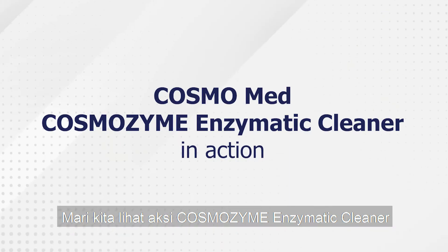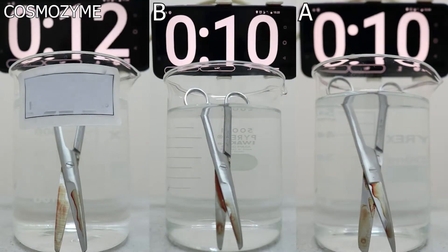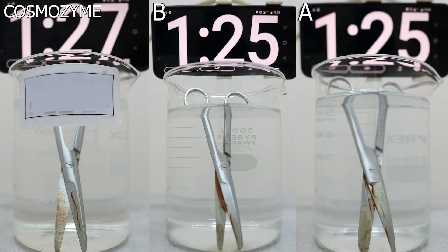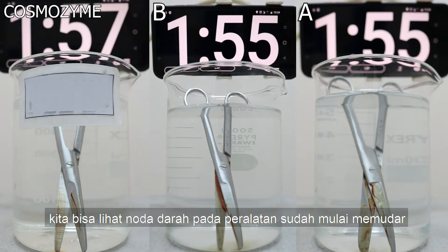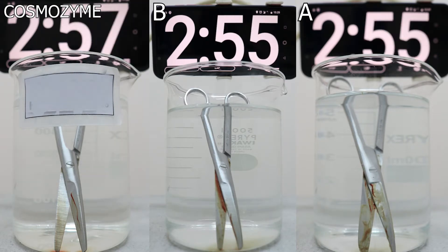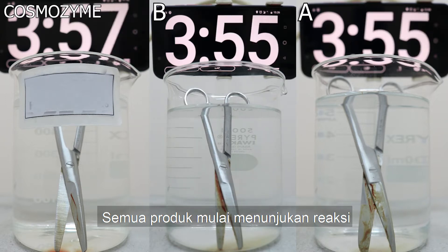And now let's see Cosmozyme Enzymatic Cleaner in action. How long does it take for blood stains on surgical instruments to be cleaned with three enzymatic cleaners? We can see the blood starts to dissolve. In three minutes of contact, all the enzyme cleaners start to show a reaction.